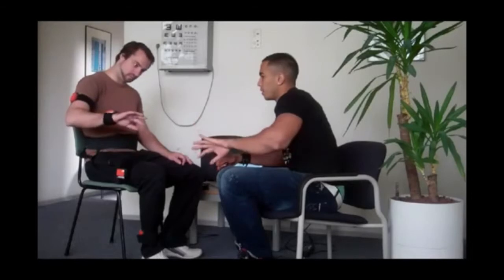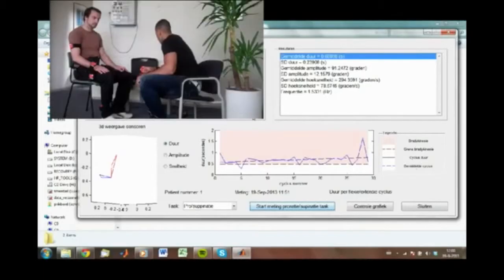Each task takes 25 seconds. Patients are asked to do it as rapidly as possible with a large amplitude. The first task is pronation supination of the forearm. On the monitor the movement is visible, as well as the duration, amplitude, and speed of movement.